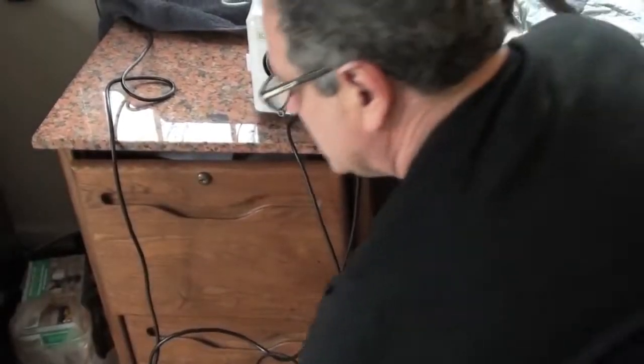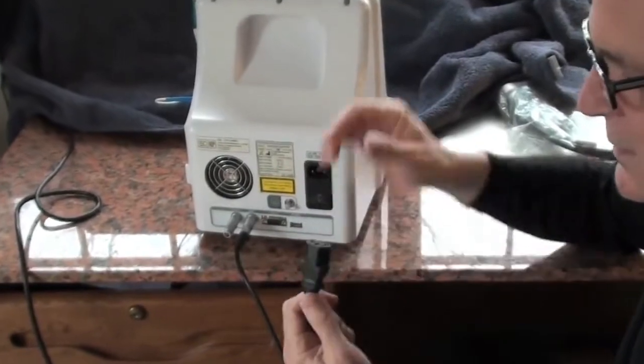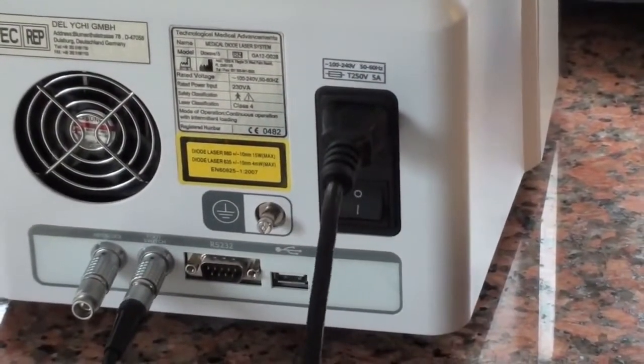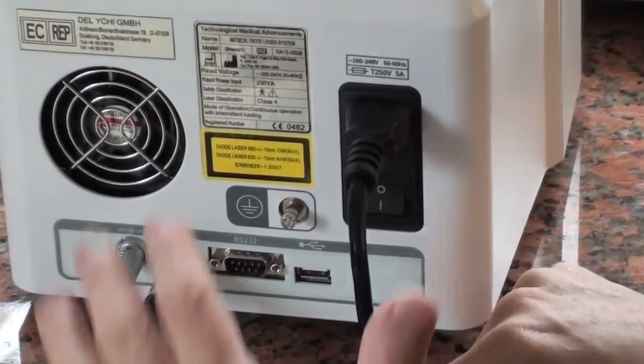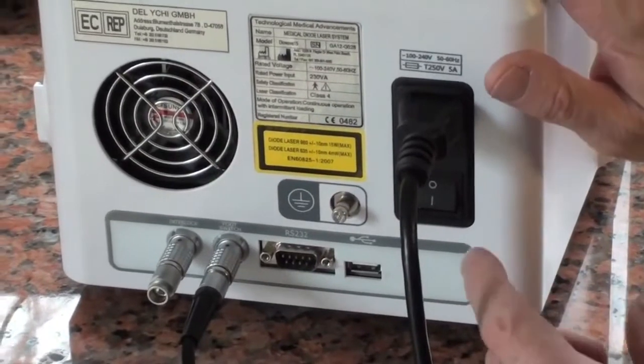The last thing that needs to be plugged in, now remember everything is turned off, is the power cord. Slips in, make sure it's tight. This is a typical classical power cord that you use in a computer. So everything is set up, the interlock, the foot pedal, and the power cord.